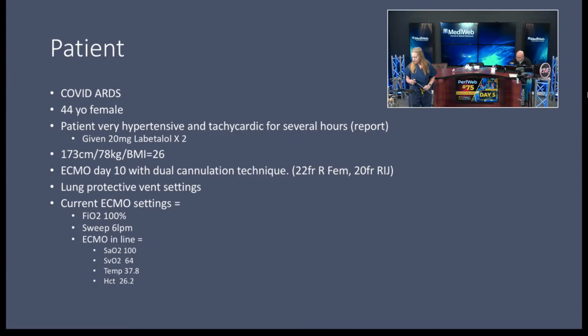I'll talk a little bit about how this device is no longer being manufactured. LivaNova is coming out with a new device. But whatever device you have, whatever platform you choose, something to think about is how mobile it is. Am I going to be able to move these patients around? With all of these COVID patients who were on for such a long period of time, we got to see that transport became a regular part of our day. We're often going to CT to get some sort of scan.